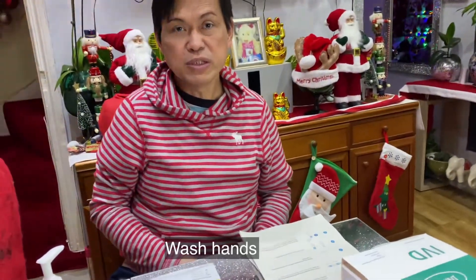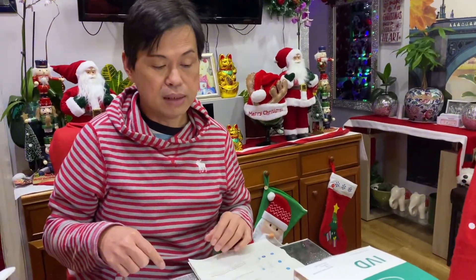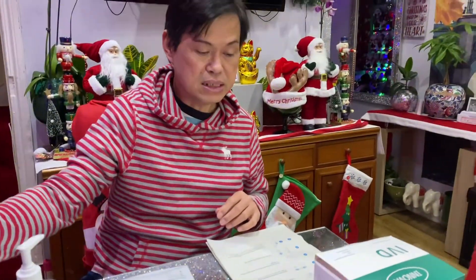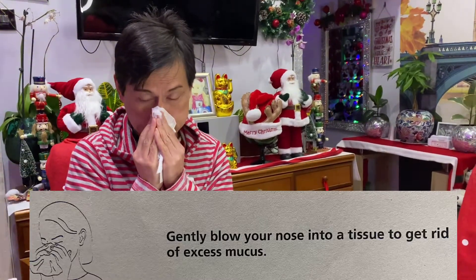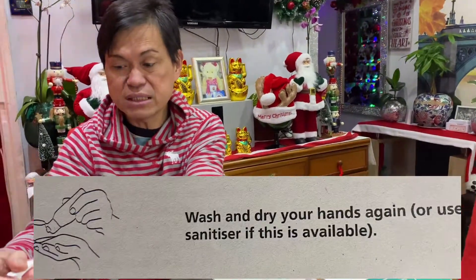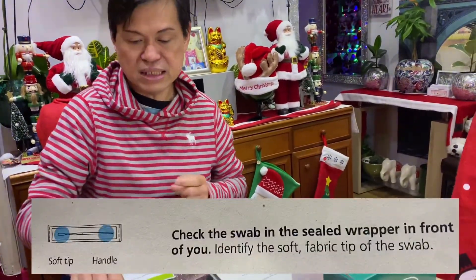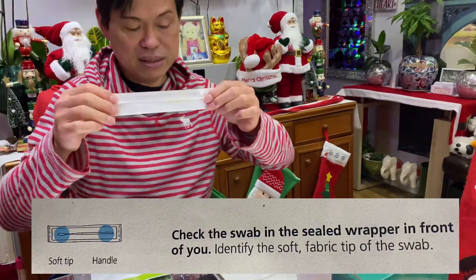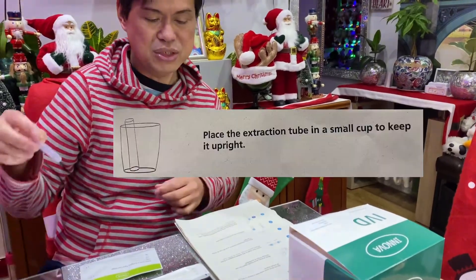First and foremost, you have to wash your hands before doing this. Now gently blow your nose because you want to clear the excess mucus, dispose of the tissue, then wipe your hands with sanitizer. Then check the sealed wrapper in front of you.